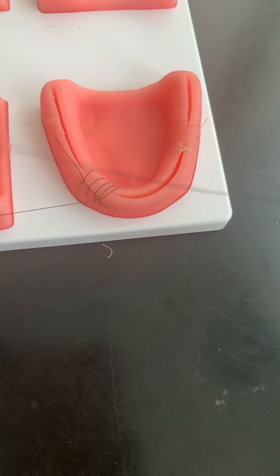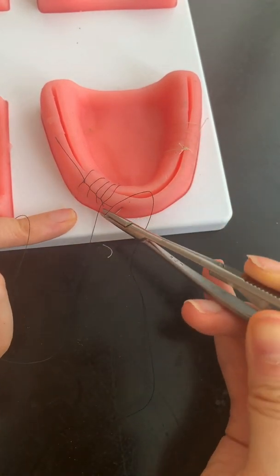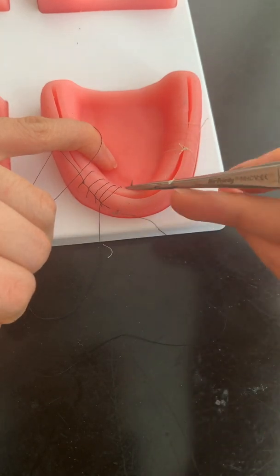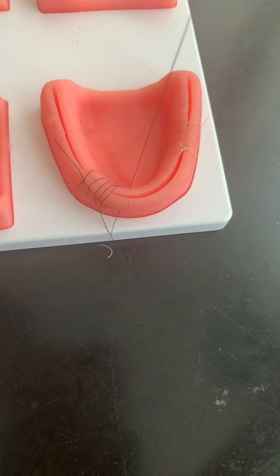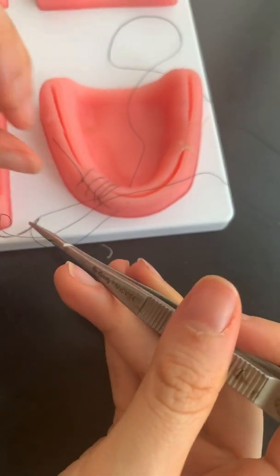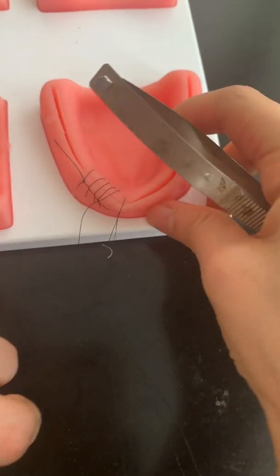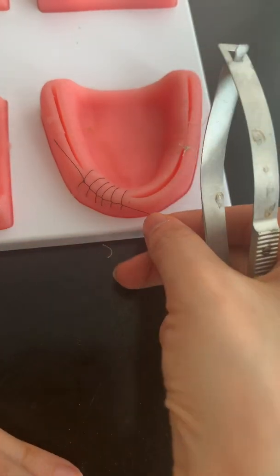So let's get in again and pull this tight. You kind of know where it starts, and then come out. I'm going to tie it off on this one. Actually, let's do one more before I tie it off to make it look more complete. And it gets caught. See that? Pretty.